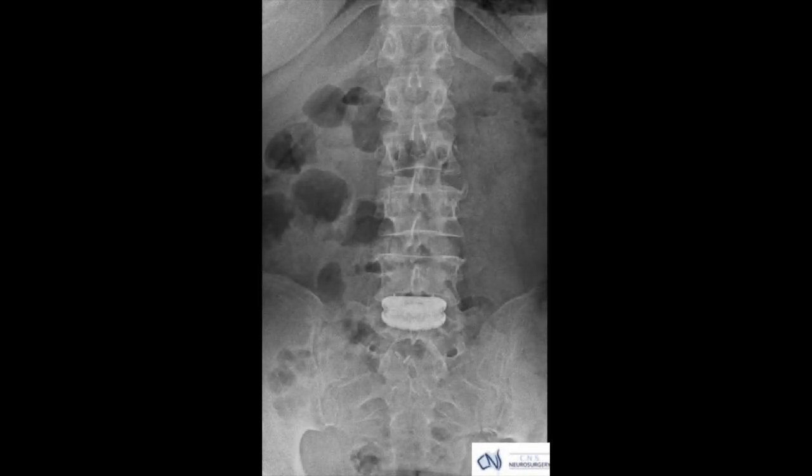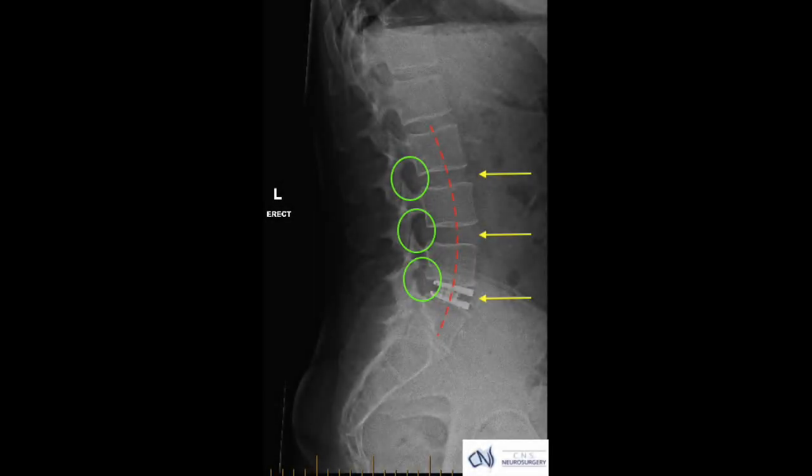This is the immediate post-operative x-ray looking at the disc from in front, and this x-ray is looking at the disc side on. You can see the beautiful restoration of the curvature of the spine marked by the dotted red line, beautiful disc spaces marked by the tips of the yellow arrows, and open windows where the nerves come out as marked by the green ovals.